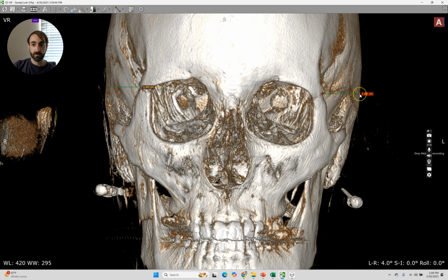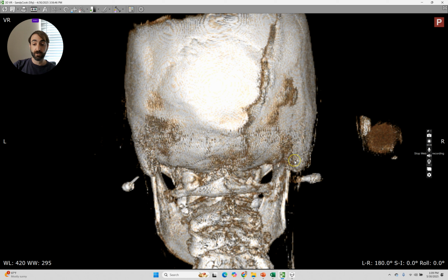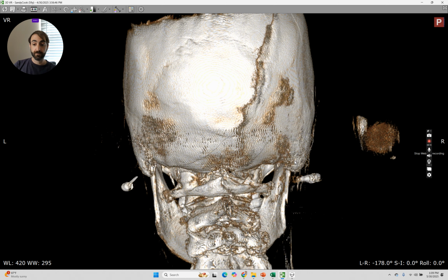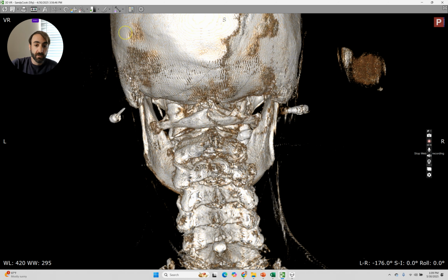1.8 and 1.89. We'll say 4 degrees of rotating the film this way is going to give us a perfect A to P, and that means if we take it from the back, then we would have to rotate it 4 degrees the other way to be seeing it now P to A, no rotation. And that's the imaging you would be doing in the chair with the patient. Now we're able to do it so much easier in cone beam with just a click of a button.